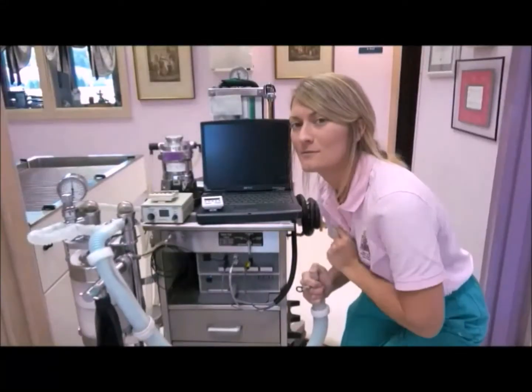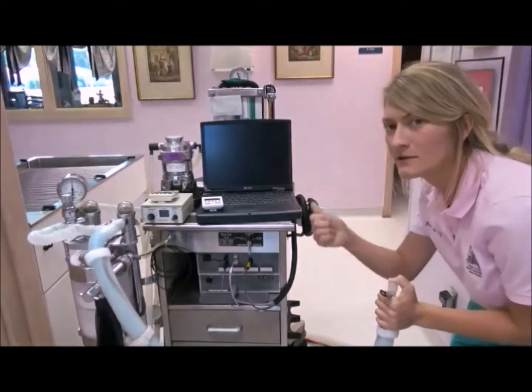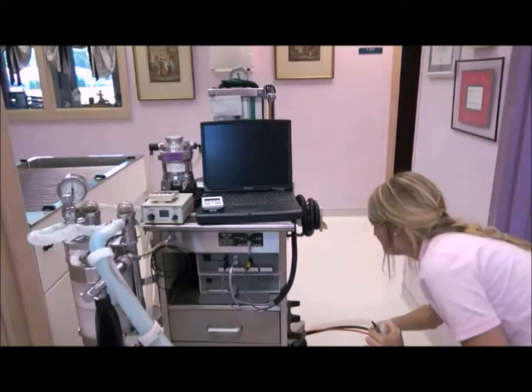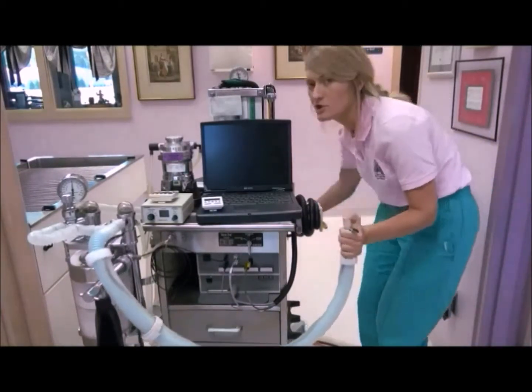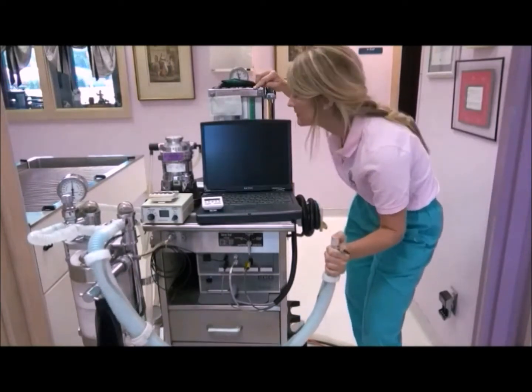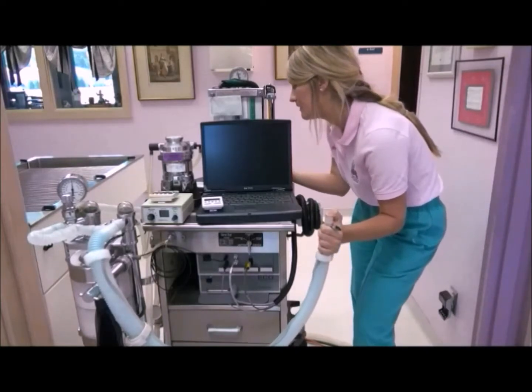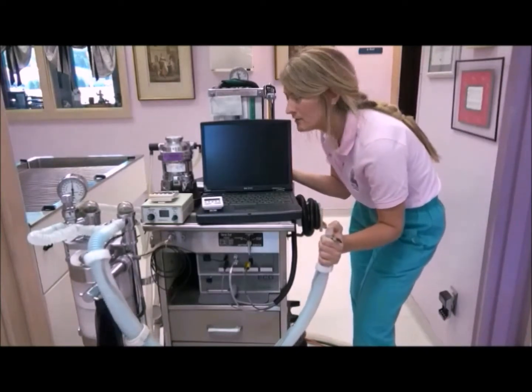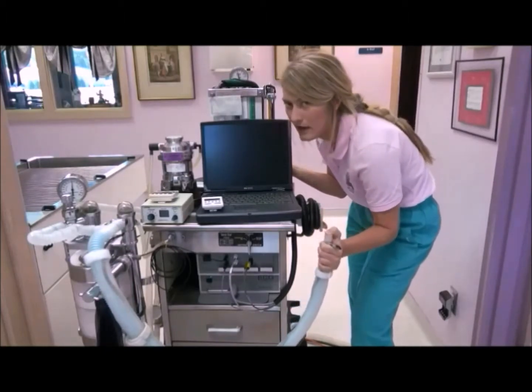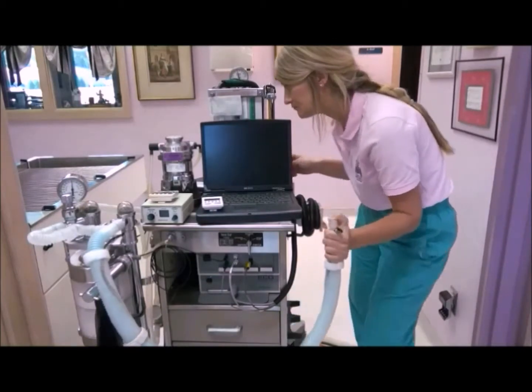At our clinic here, we use a rebreathing anesthetic machine. So how it works is, first, once we have the oxygen line connected to the oxygen wall connector, it then comes into the machine here. The oxygen comes to the flow meter first. So once you turn the flow meter on, you must read the top of the bobbin, wherever it lines up, that shows the amount that you have the oxygen set to. So the oxygen will come in at the bottom of that.